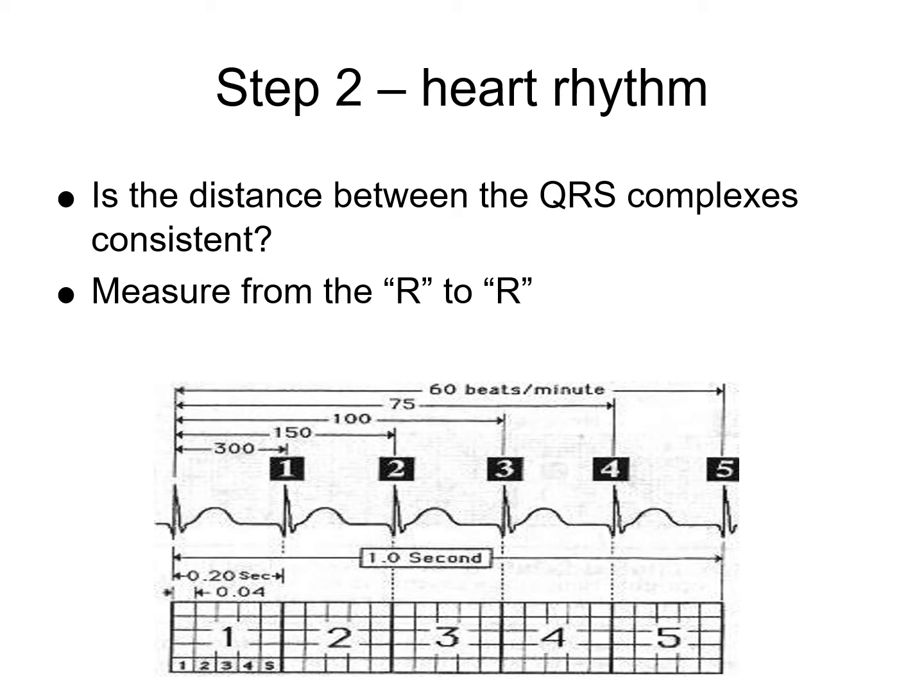Irregularly irregular is where your R-Rs have no similarity, and that's more like an AFib. A flutter, especially with a 2-to-1 or 3-to-1 block, means you have one QRS for every 3 P waves, then 3 P waves and 1 QRS, 3 P waves and 1 QRS. That's regularly irregular.